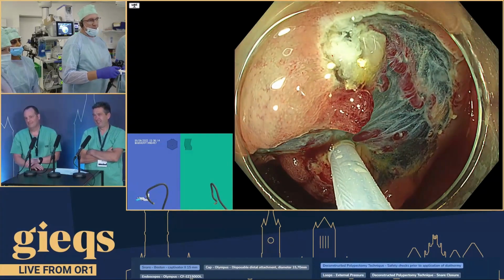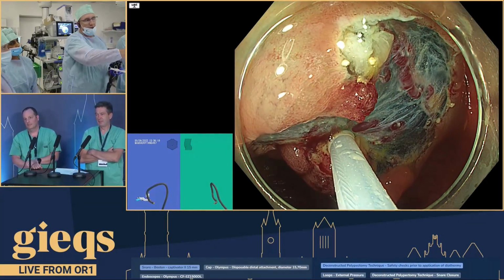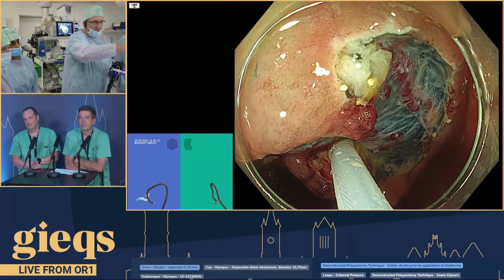And the point I was making was, it's very important. So sometimes when it's very difficult, we get a red out, or you're under fluid or behind the fold.